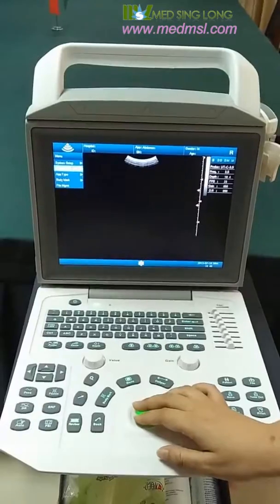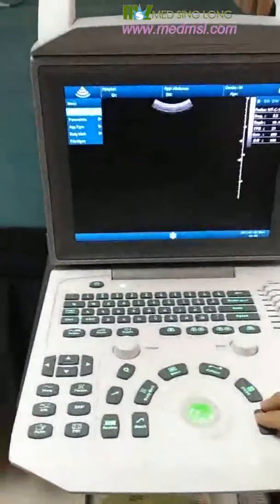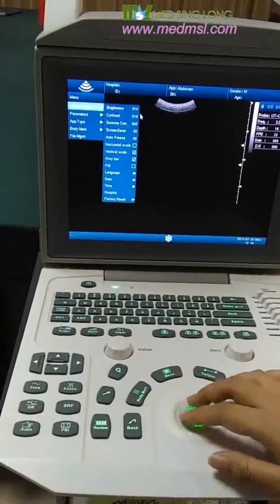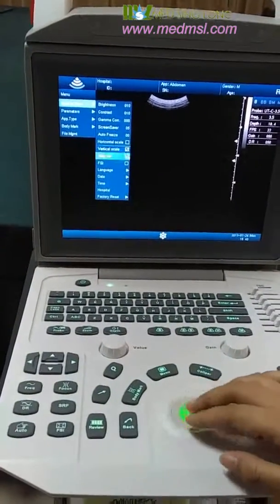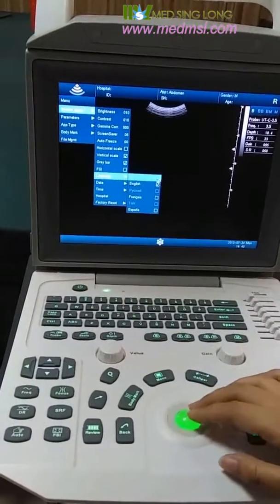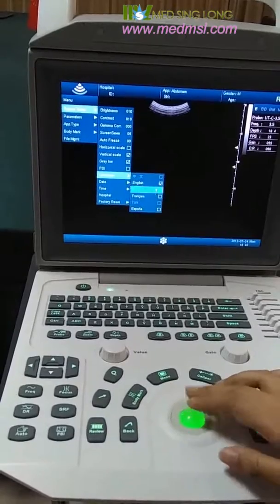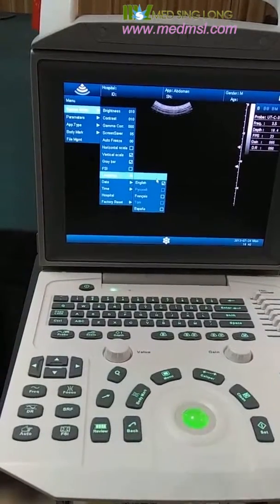Then we come to the parameters and system setup. In system setup, you can set different things. About the language, I would like to mention that there are four options: English, French, Spanish, and Chinese.